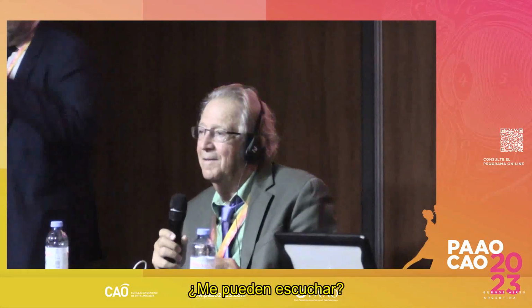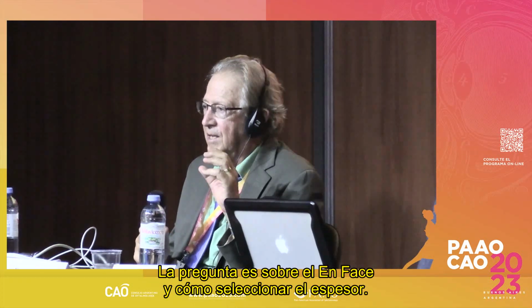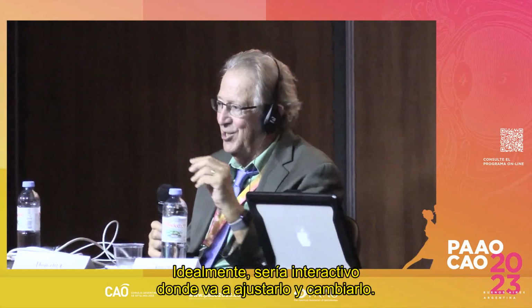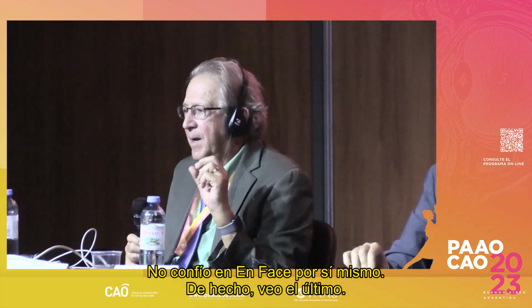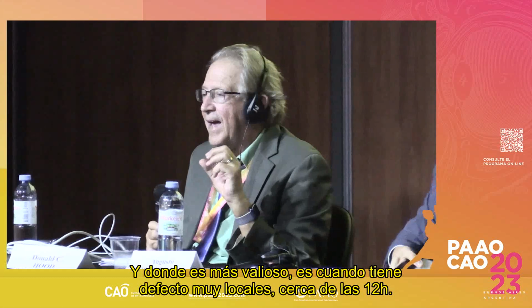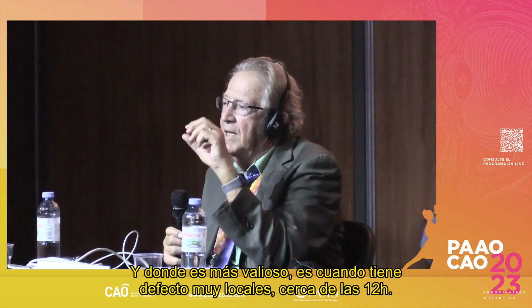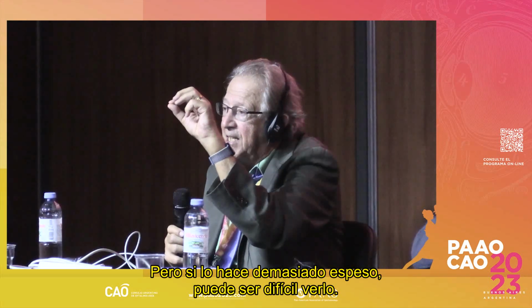Can you hear me? Yeah. So the question is about the en face and how do you select the thickness. Ideally, it would be interactive where you could adjust it and change it. I don't trust the en face by itself. I actually look at that last, and where it's most valuable is when you have very, very local defects, if it's real, up near 12 o'clock, right? But if you make that too thick, it might be harder to see this, right?